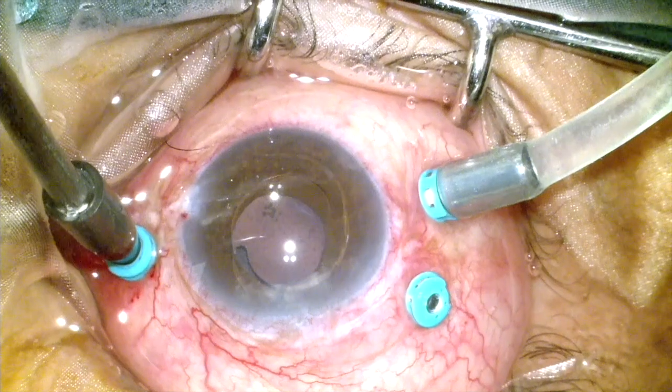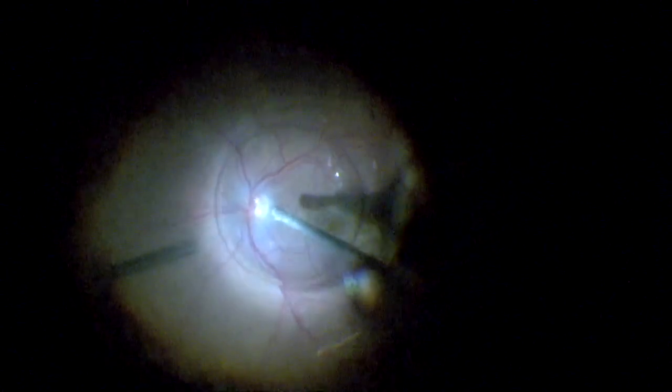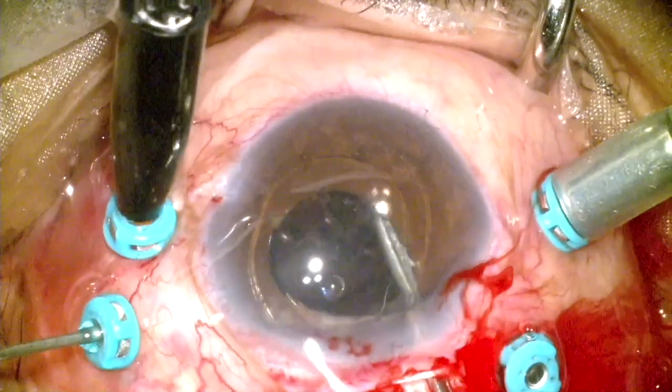So I planned to remove the dislocated IOL, but when I entered the eye, I could see that the vitreous was all present and PFCL had been used without inducing the PVD and clearing the vitreous. So first was to clear the vitreous and remove the PFCL. Then I used a chandelier illumination, put a small bubble of PFCL to raise the dislocated IOL, and using bimanual handshake technique, oriented it such that I could remove it between the AC lens and the iris.